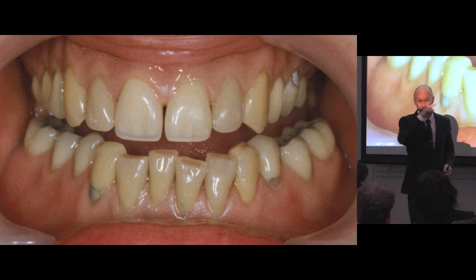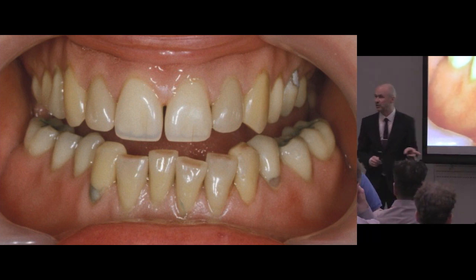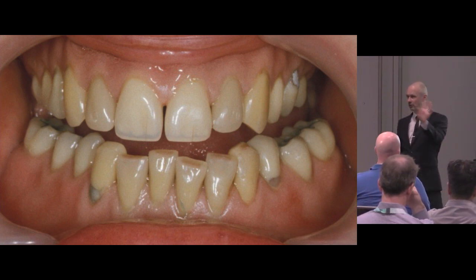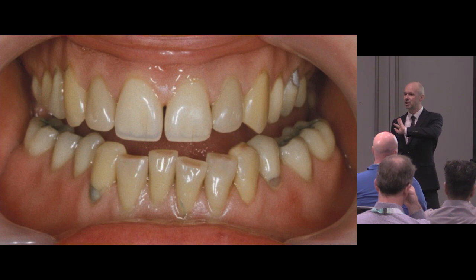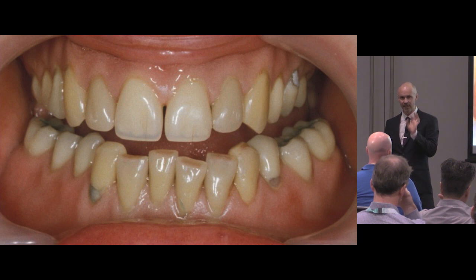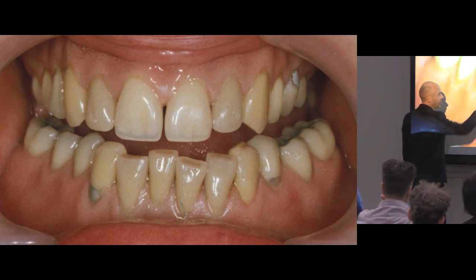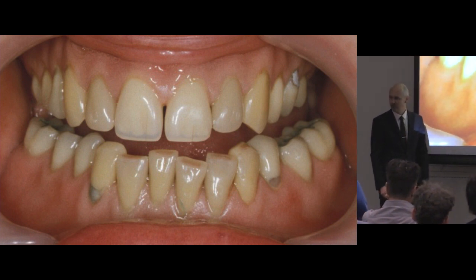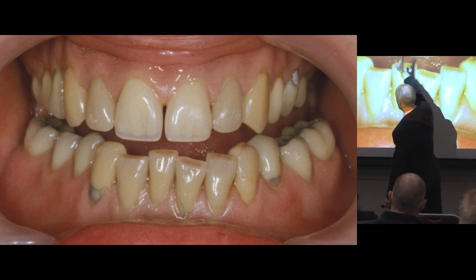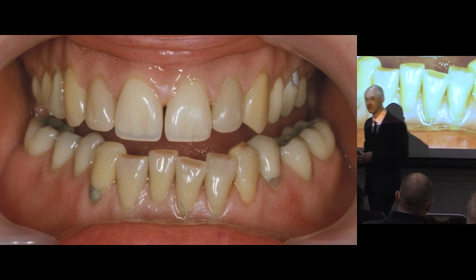And what I do is, at the trying stage, before it's been processed and finished, no, in fact, that's wrong. Once the denture has been processed and finished completely, before it's characterised, I'll get a Sharpie pen and put a black mark there. So we want an amalgam there, and then we want a tatty composite up there and a crack line. So I just put lines on with Sharpies, and then Rowan just puts all these different characterisations in.